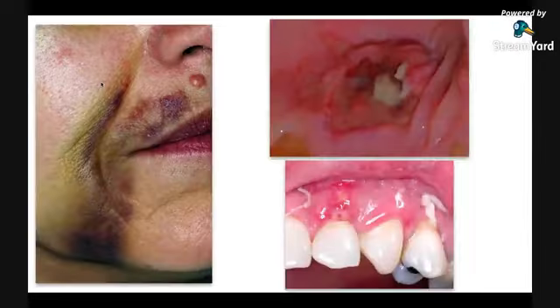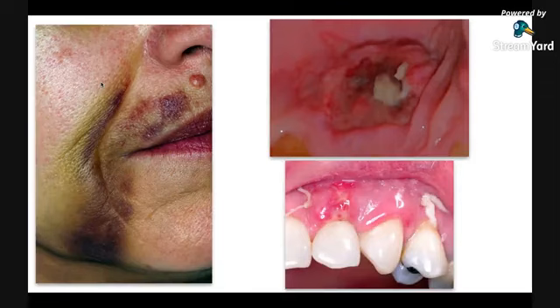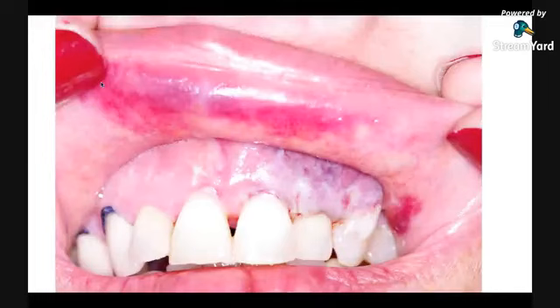In the post-op care, of course, we have some problems when we use techniques that we invest a lot of time on. Here you can see my patients when I started in this field, look at the hematomas, the necrosis, I lost stitches, I lost sutures. I had a lot of problems. It's a learning curve. Here you can see the hematomas, it's a bleeding here in the canine. I was losing the connective tissue graft because I can't seal the sulcus with sutures. So these are things that I wanted to improve.